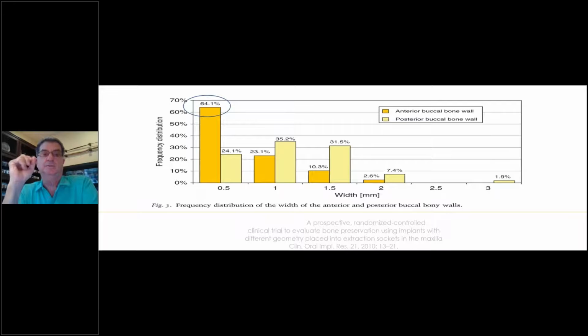That's the 6 anterior teeth. Another 23% is 1 millimeter. So just as Abdul said, only 10% is over 1 millimeter. 10% of the anteriors. This is human data. So what we see here is that we actually assume that almost all of our anterior teeth have thin buccal plates. And that's why you saw some of the problems that Abdul so well showed you.